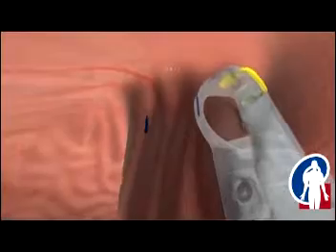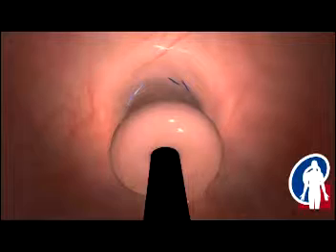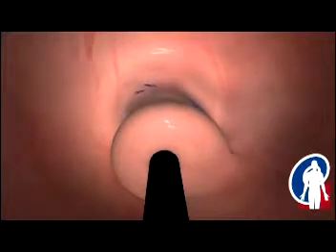The wrap is then tightened further, and the next pair of fasteners are placed 1 centimeter above the Z-line. This procedure is repeated on the opposing side. The valve is extended, creating a long 3 to 5 centimeter flap and securing it with H-shaped fasteners.